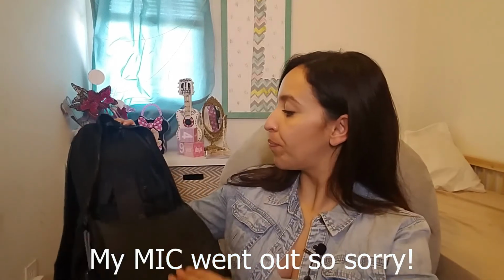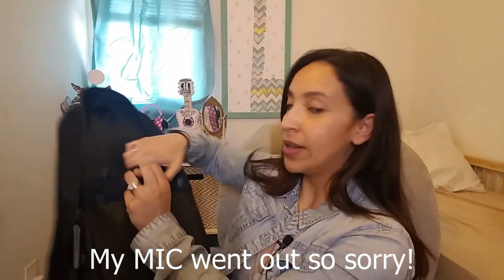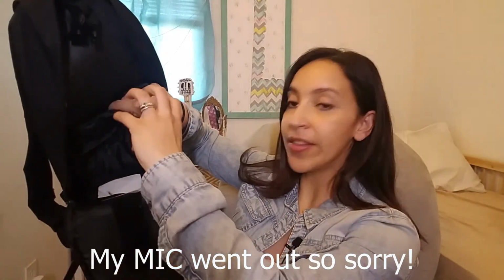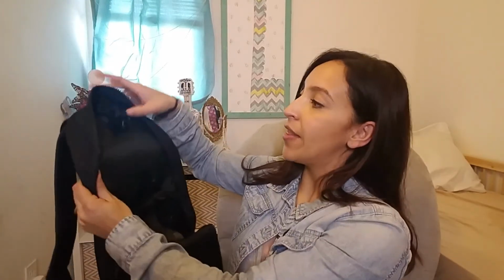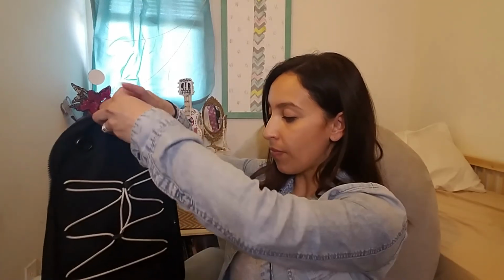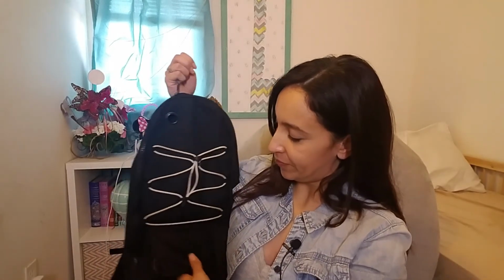But to go, if you open it up, it has a Velcro. You unvelcro that and then you stick the Joey pump inside of here, and you can secure it with the Velcro like that. And then it has these little latch things, where you hang the bag. You clip that right here so that the feeding bag stays in place. And then you can zip it up. And right here it has a clear plastic where you can program the Joey pump for on-the-go feeds.